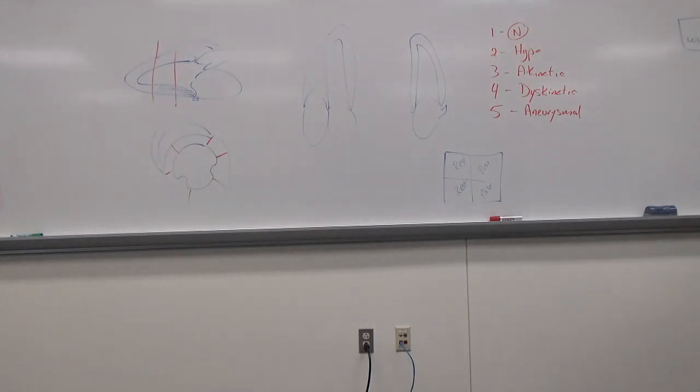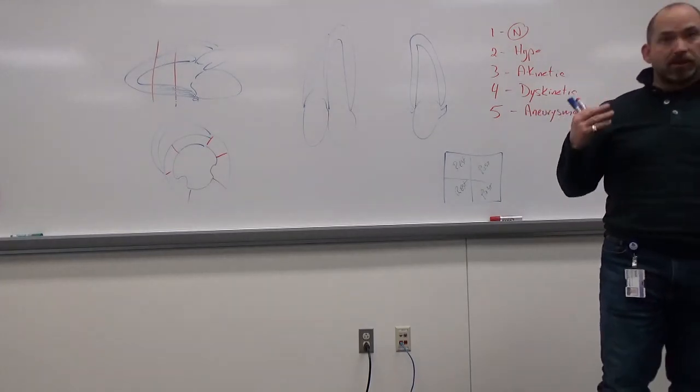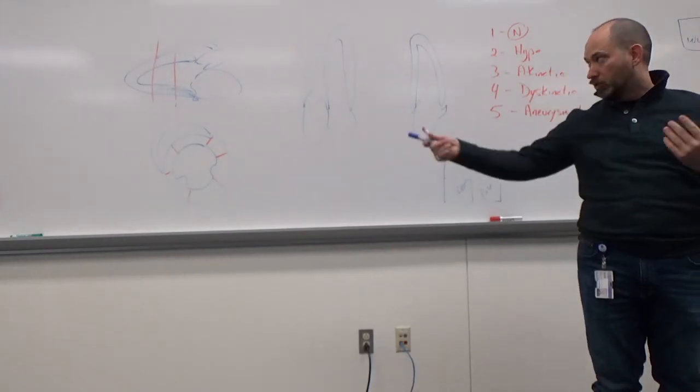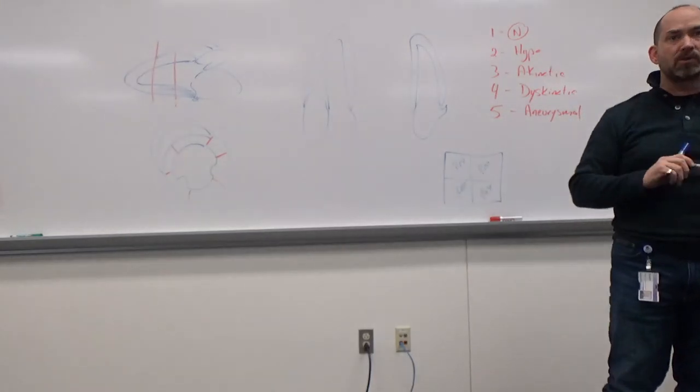Any other questions on stress echo? All right, sorry the slides were boring. Most of stress echo doesn't show well on a still picture. That's why I didn't have a lot of stuff to show on there, because really, when it comes to wall stuff, and like I say, for this next exam, I will have video clips, and those video clips guarantee you are going to be wall segments. So look at the actual hearts beating, be able to identify what walls they are, and be able to associate what coronary arteries supply those walls.